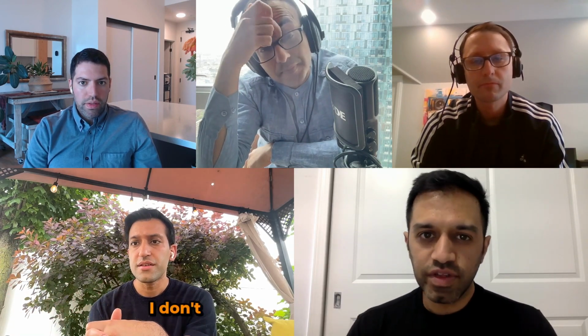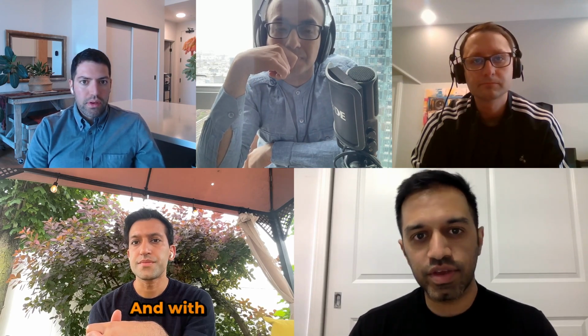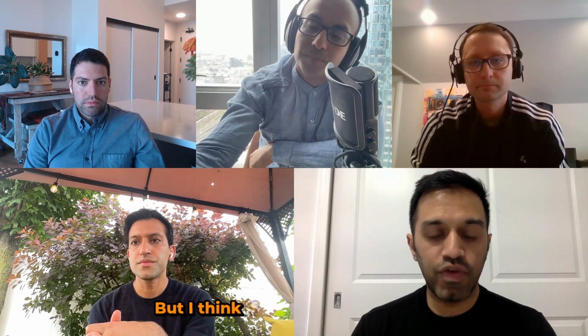And do you separate labels, like this is undiluted, this is diluted? Some people send the cassette. Do you do all that? I don't send the cassette anymore. I found that's generally not necessary. With the cassette, it tends to be so diluted out that it ends up being a little too dilute to be useful. But I think if you're really staying in vitreous, that's the other thing.